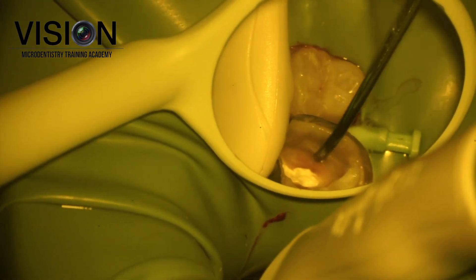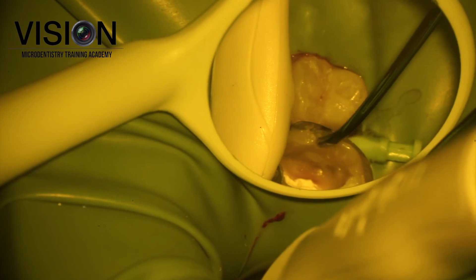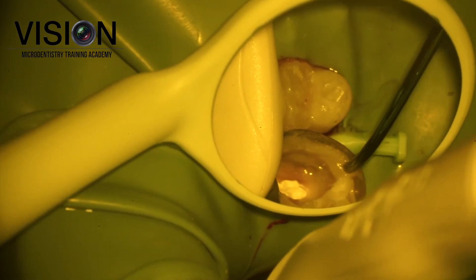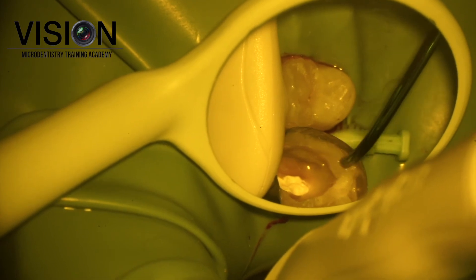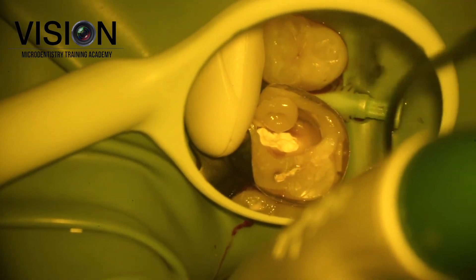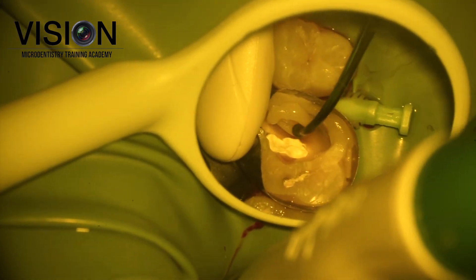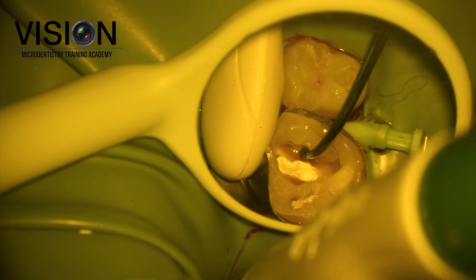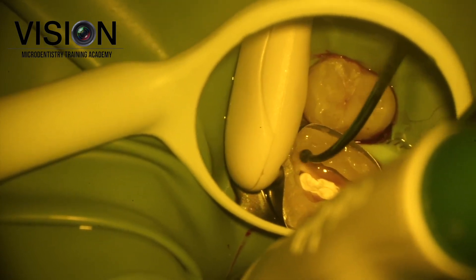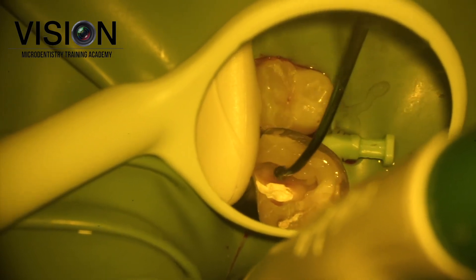A 360-degree or circumferential matrix in such a case helps in contouring the entire surface of the missing walls, unlike sectional matrices which may or may not cover the entire tooth surface. By adding multiple increments, we can basically re-contour and rebuild that wall which is missing and reinforce the remaining tooth structure.